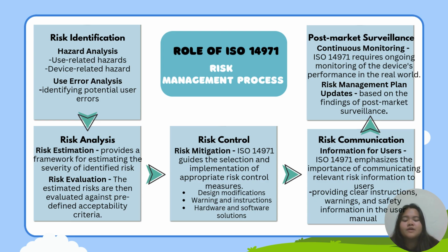Next, we come to risk evaluation. The estimated risks are then evaluated against predefined acceptability criteria. This determines whether the level of risk is acceptable or requires further action. Now we come to risk control.